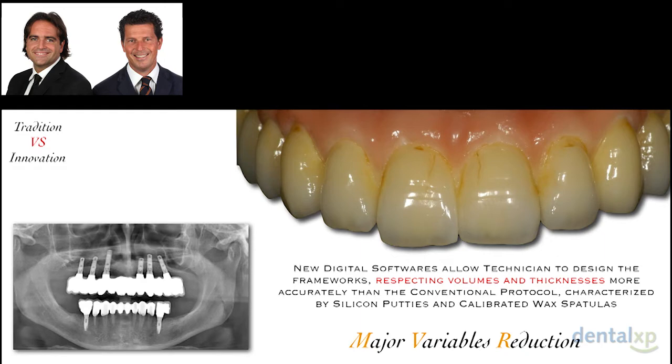Summarizing this first part, it is clear how important the advent of the new digital software has been in the technician workflow, allowing them to customize the framework design, respecting volumes and thicknesses more accurately than the conventional protocol.